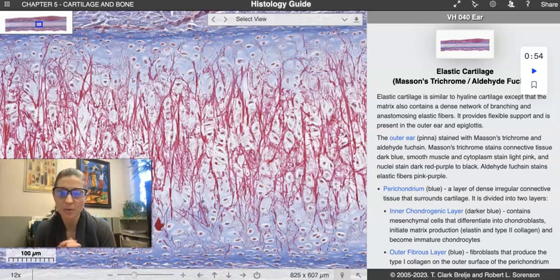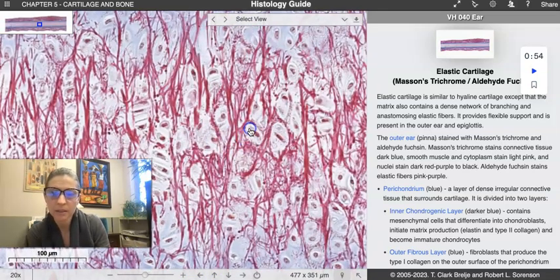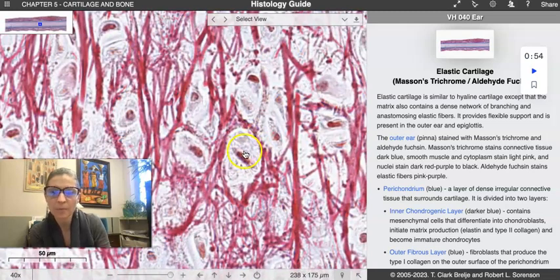And so we're talking about the fibers in the background and how there's a scattering of fibers that you see here, and that the cells are really interdispersed between all of the different fibers. And if we were to go in here and take a look at some of the cells themselves, if we click and dive in a little bit further, as it takes a minute to refocus, you can see again this background, all this pink material, is going to be all that elastin.